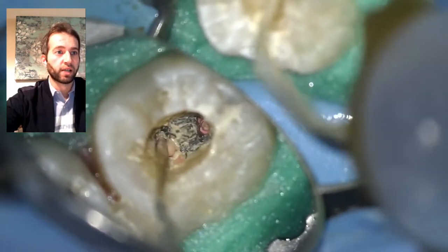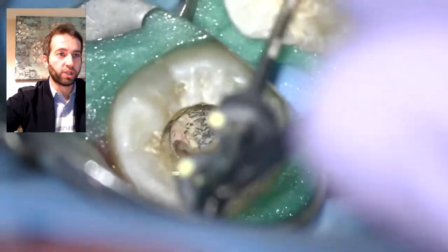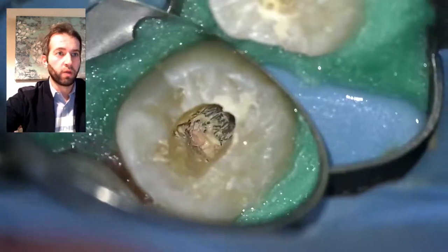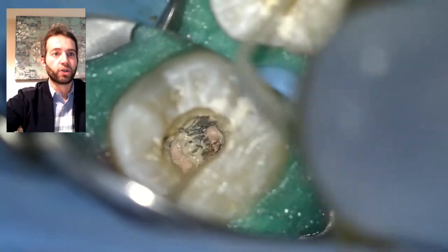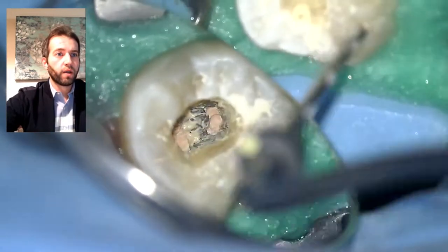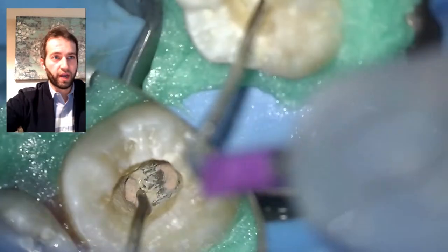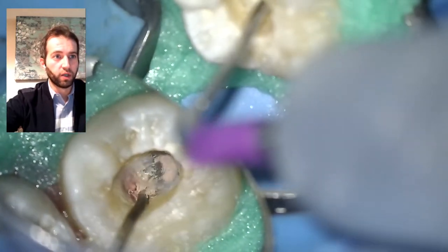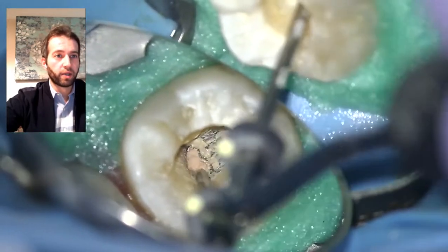This is backfilled thermoplasticized gutta-percha — it's flowable, molten gutta-percha. You backfill the portion that was seared off and then condense it with a cold plugger at the orifice level. Make sure it's seared nicely with no excess gutta-percha and no overflow covering your chamber. I take my time to make sure there's a nice sear at the orifice, and I sometimes use System B again to remove any excess and smooth it out.